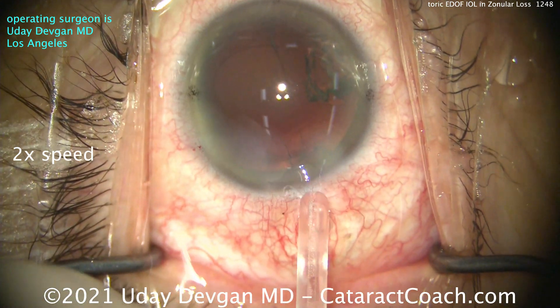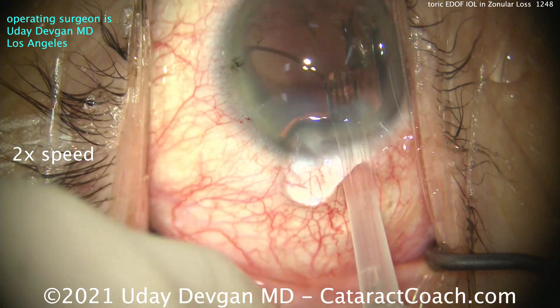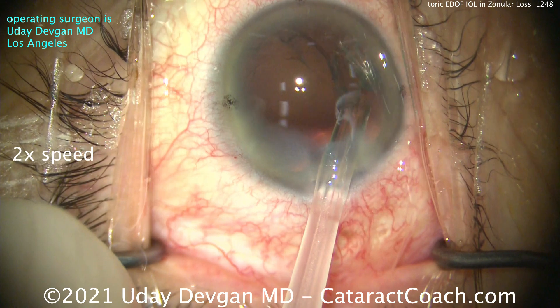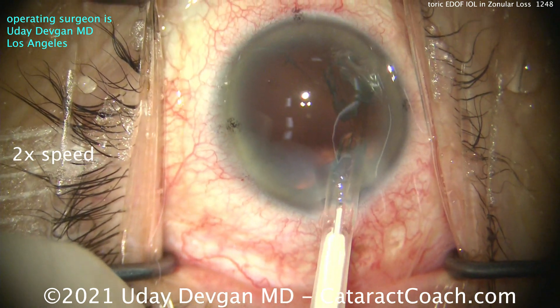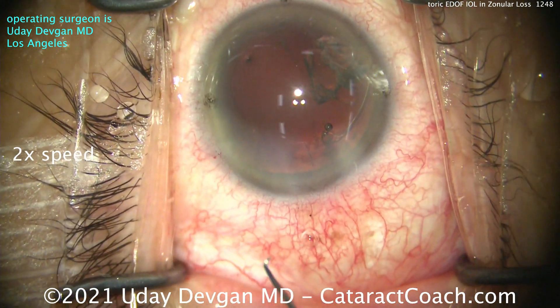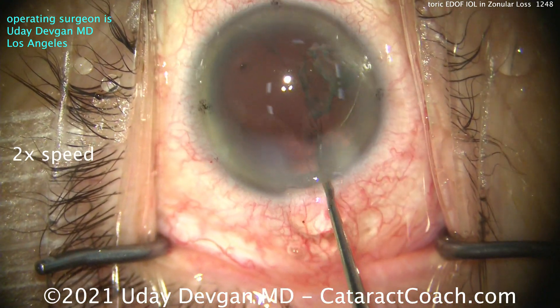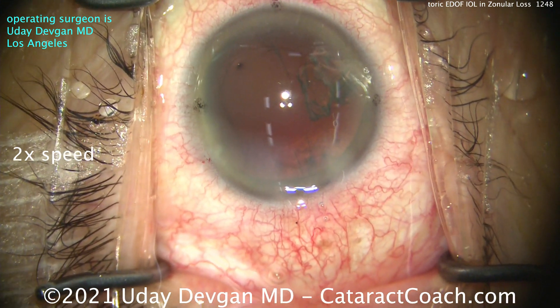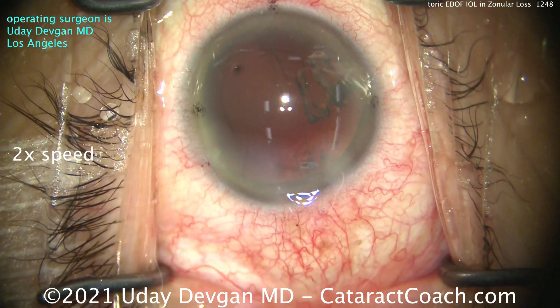There's still a little bit of epinuclear shell, but let's put in the CTR — capsular tension ring going in. Now you can put this in a variety of ways. We're going to angle it over here and see if we get that thing to spin around and go in. I feel a little bit better already. Is that trailing hook in the bag? Let's get that in there. Whew — still not out of the woods yet.